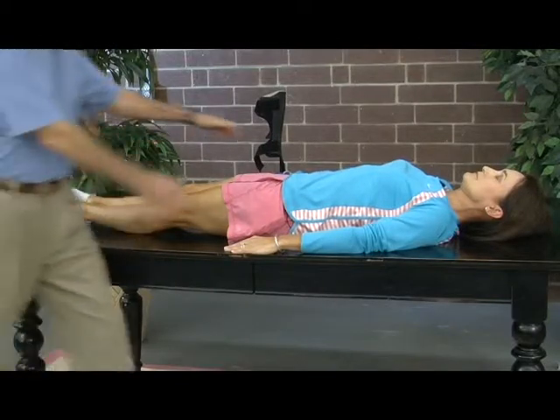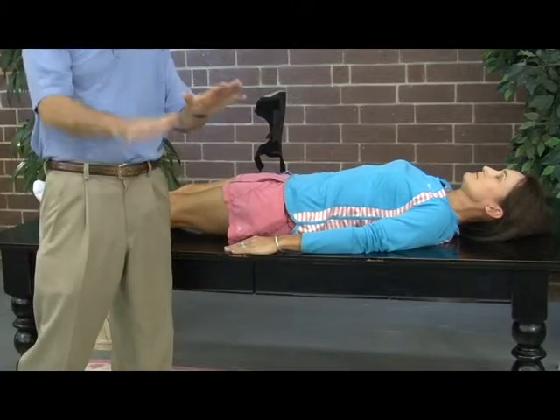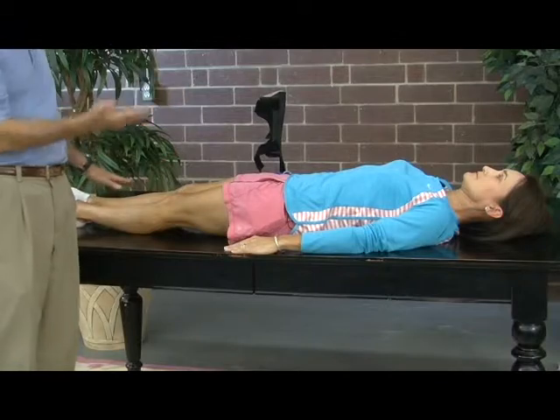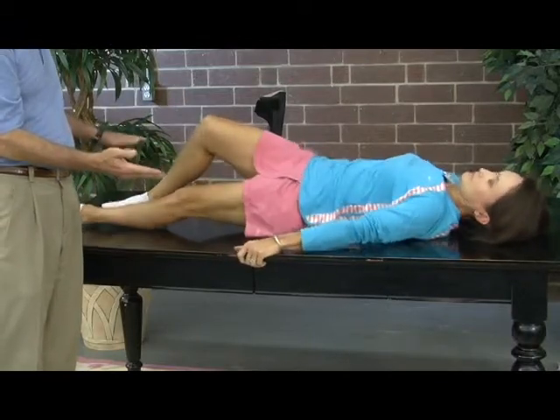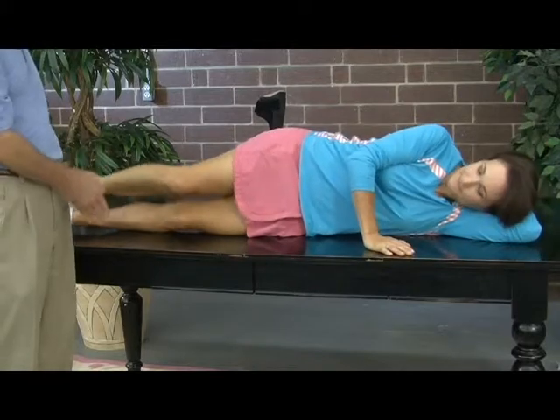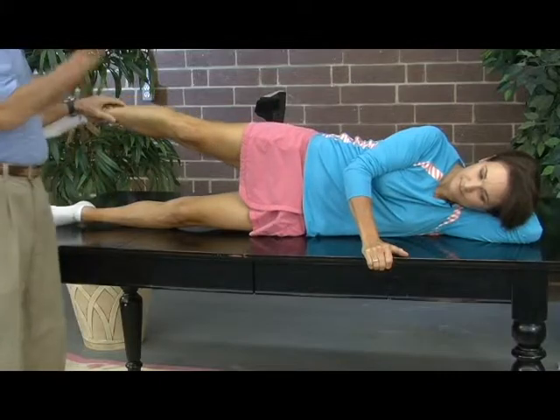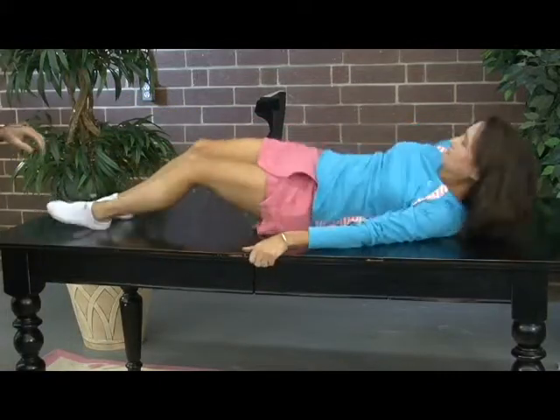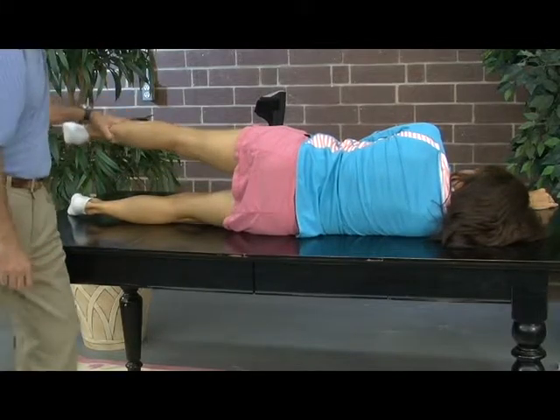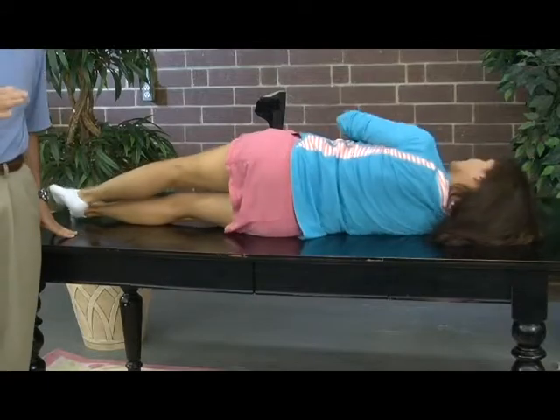Third was things like your leg length — were they absolutely equal? Did that require some difference in brace? Fourth was strength — did you have enough strength to have normal stability in one type of brace versus another? Someone with very profound weakness above the ankle or foot might require a different type of brace. But our goal in all this was to make sure you ran with as normal a form as possible — I want that left leg with the brace to look just like the right leg in your running form.